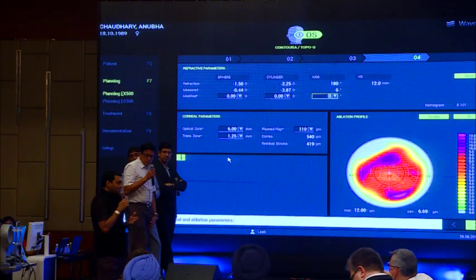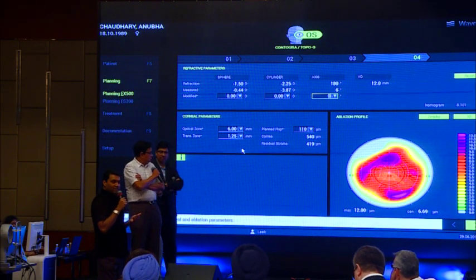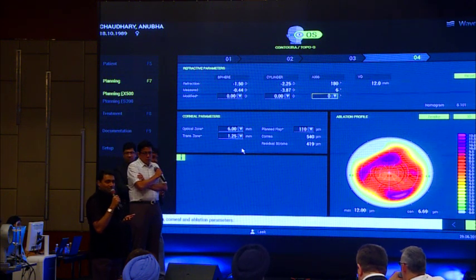So the original FDA protocol was with patients and corneas that had no higher order aberrations. There were selected corneas where the difference between the manifest and measured was almost none. And this is the interesting portion that I would like you to take with you as information. We did treat patients with no higher order aberrations or a low amount of higher order aberrations, but the patients gained a line in vision. So that means these patients on whom you did an FDA trial would have benefited even without CONTOURA. And this is exactly the interesting thing.